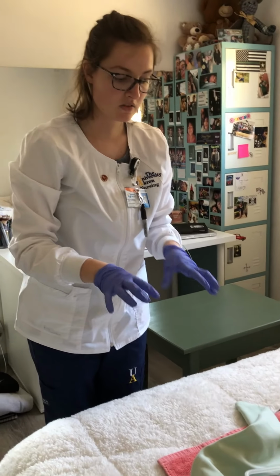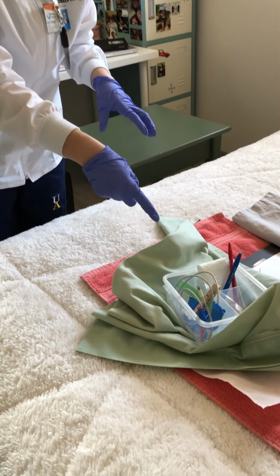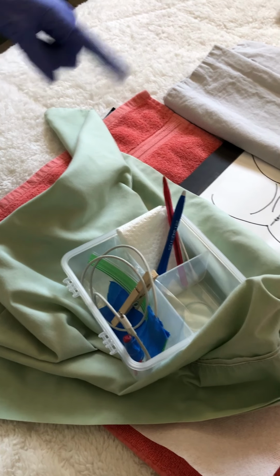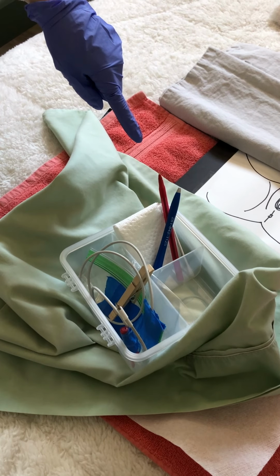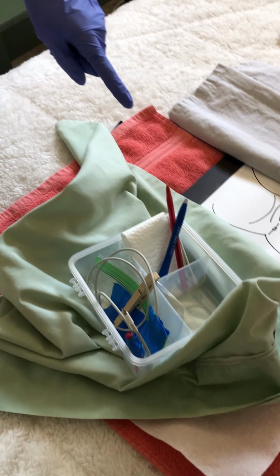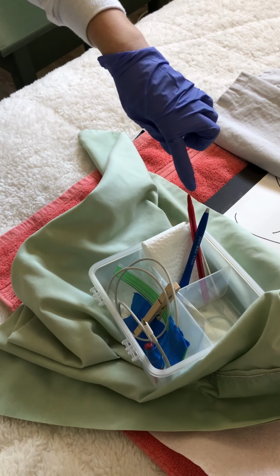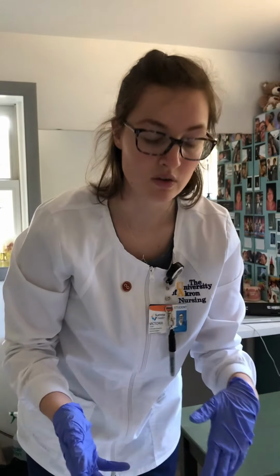So as you can see in the sterile kit, we have the catheter tubing and the collection bag. We also have the fenestrated cloth that I'm going to demonstrate how to use in a second. We have the pre-filled syringe with sterile saline that we are going to insert into the port to inflate the balloon towards the end of the procedure, and then we have a syringe filled with lubrication, and then we also have Betadine swabs to clean the perineal area.